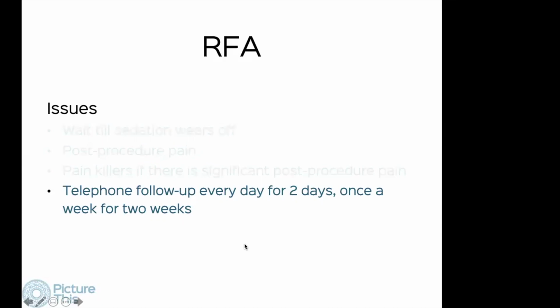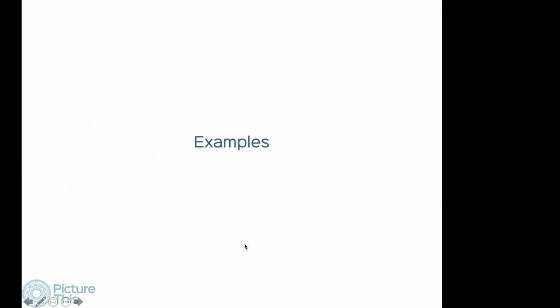We do tell the patient that if they have recurrence of pain, the classic pain that they had prior to the ablation, usually night pains, usually these respond to salicylates and painkillers, and if these recur, then they have to call us, and then we will re-image them to see if there is recurrence or not.